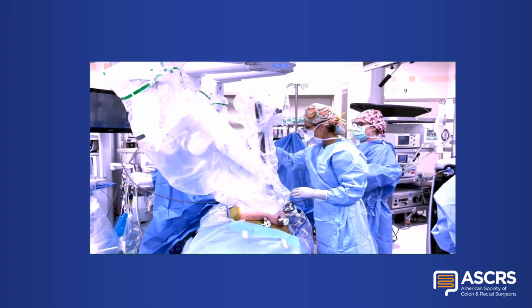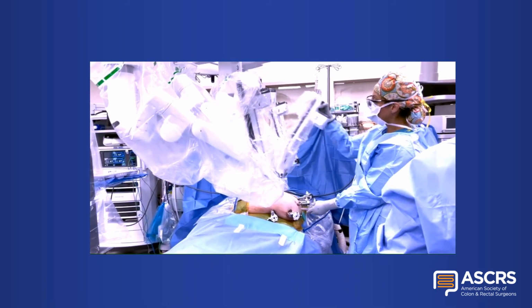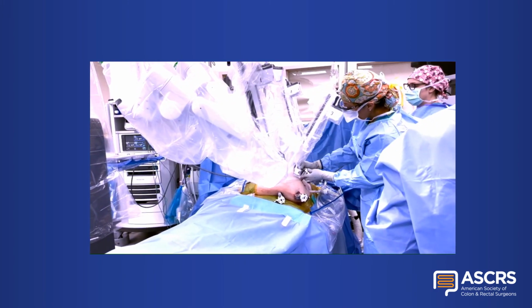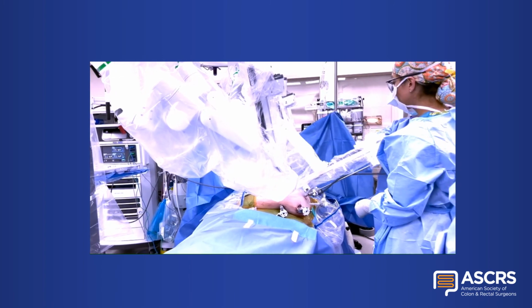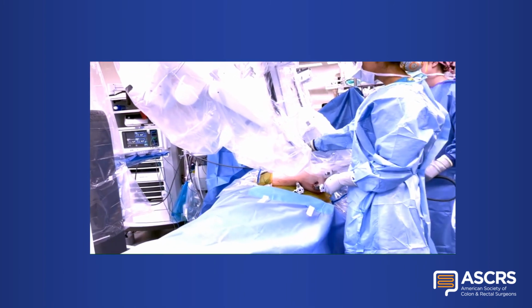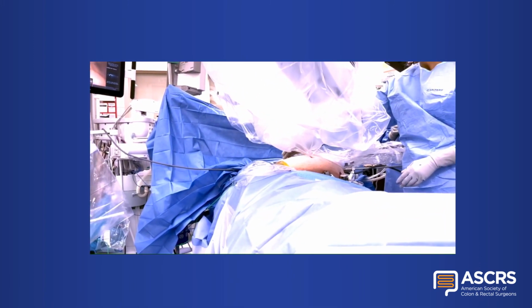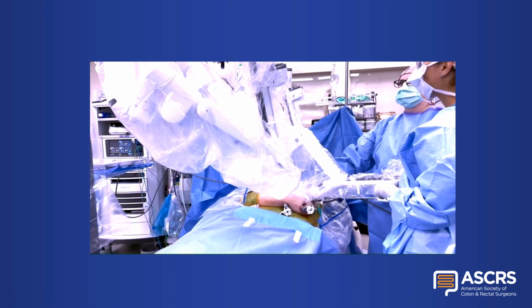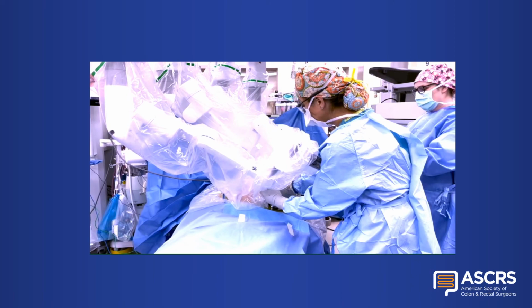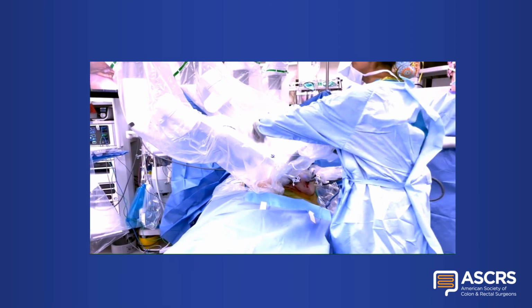Thereafter, we will install the endoscope to the robotic arm. The instrument clutch button gradually inserts the endoscope to the point, and we will target the anatomy, which will be the ascending colon in the case of right colectomy. After targeting has been achieved, we will insert the rest of the ports to the robotic arms.